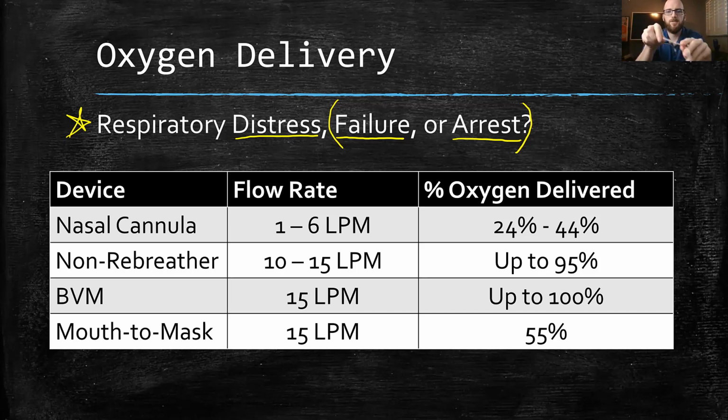If you look at these, you can see the curvature of those prongs. They're curved back, and that curve is going to go into the nose that way. So you're just going to put that in the nose, and then go around the ear, and you can cinch it up underneath their chin just to help stabilize it in place a little bit.